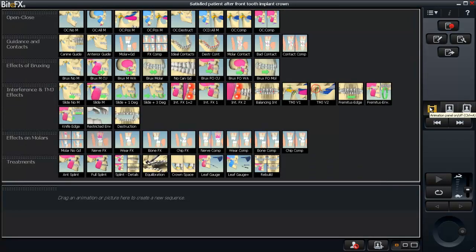Let's go back to the animations. I'm going to create a sequence that I use routinely to get acceptance with splint therapy. One of the problems I found with treating occlusion disease is it's a difficult concept to explain, but it's a very predominant disease that affects the majority of my patients. I see problems with tooth wear, hyperactive muscles and headaches, teeth breaking, teeth that are sensitive, and even bone destruction.